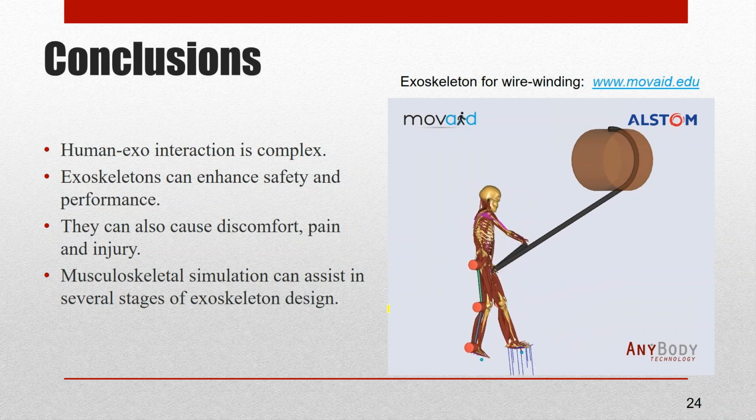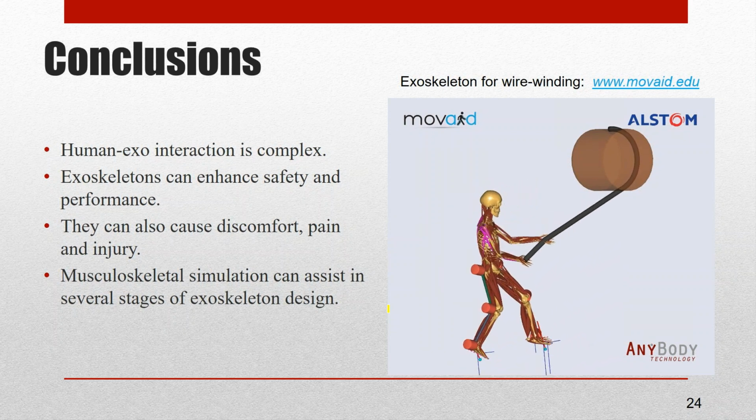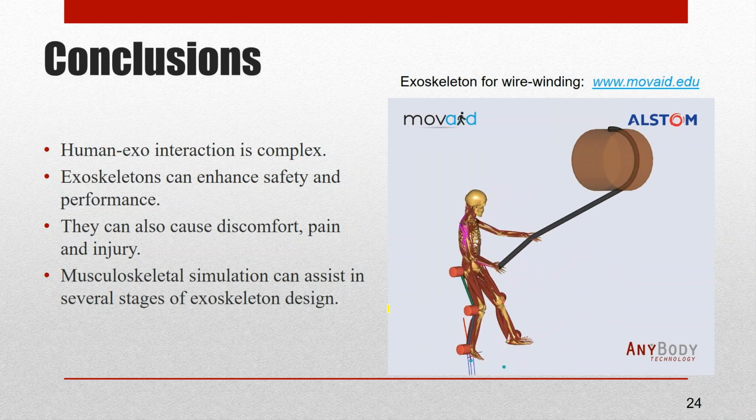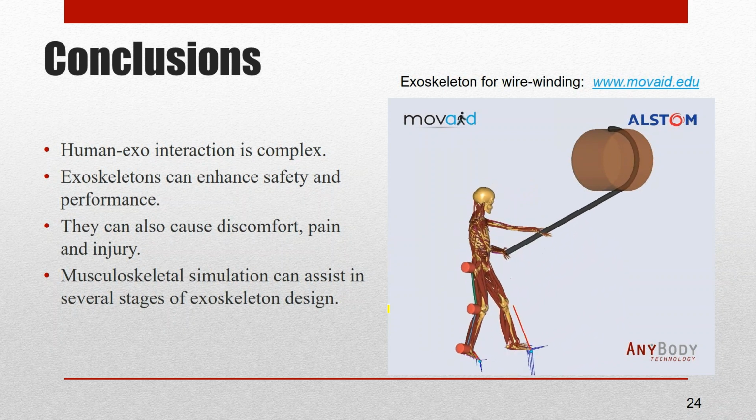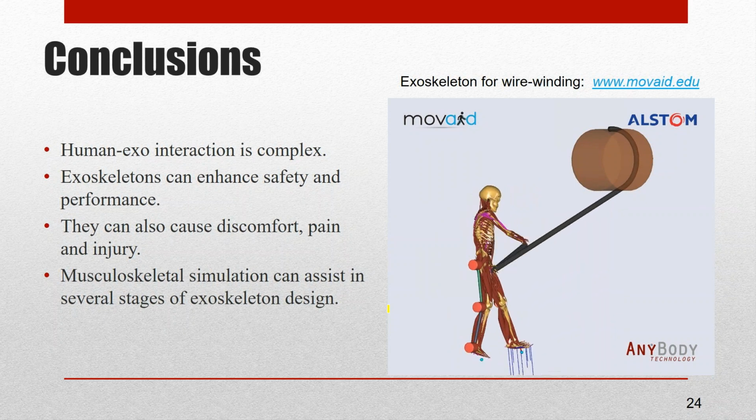So being able to understand all of these things and how the exoskeleton influences the human body, I really think it's very difficult to do that without having a comprehensive biomechanical model to support you. And this is what we can do with the type of models I've shown today.